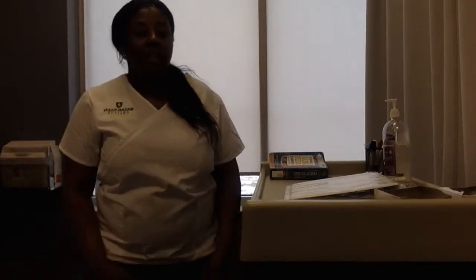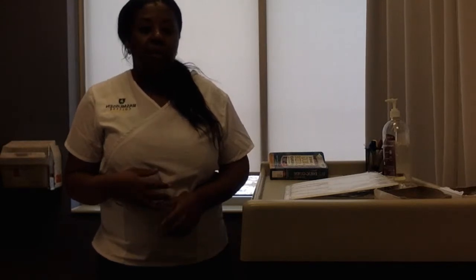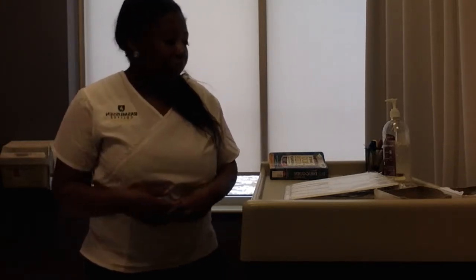Okay, I'm Angie. I am going to do an intramuscular video and I am going to show a proper injection. So first I want to begin with my hand hygiene.